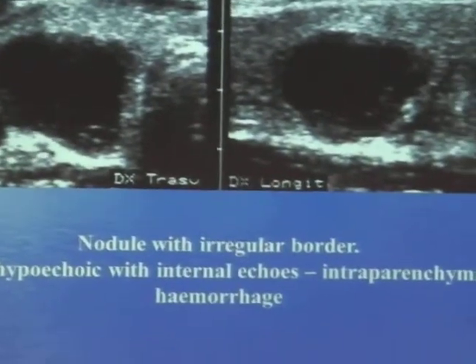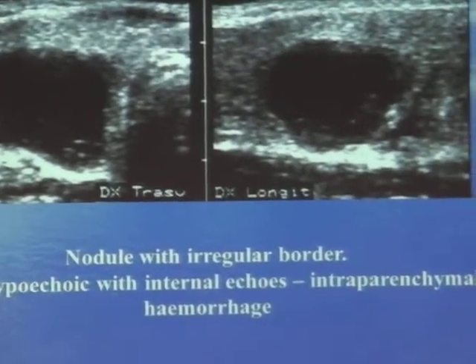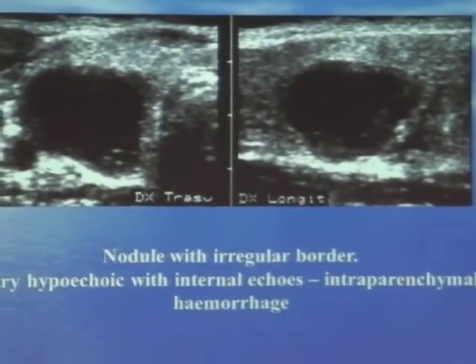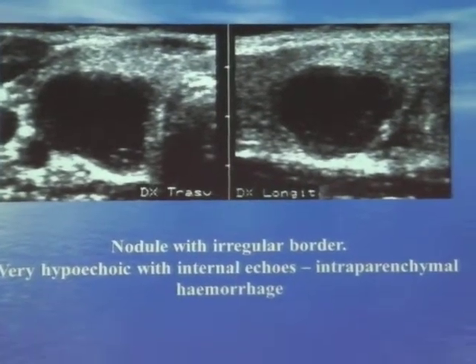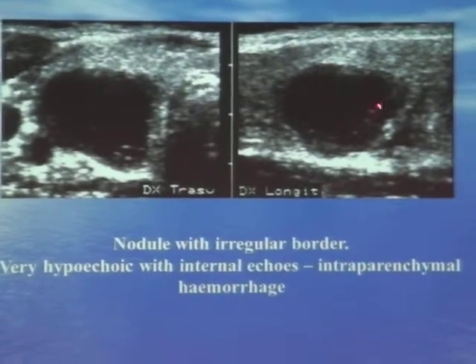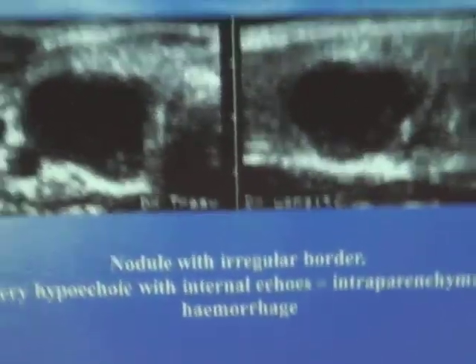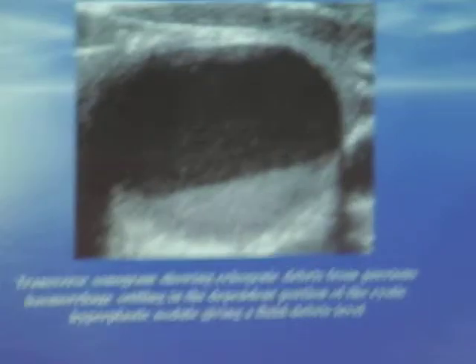Now if you look at cysts anywhere in the body, whether it's in the thyroid, the breast, or the ovary, you classify your cysts as simple cyst and complex cyst. A simple cyst is a cyst that you can draw the outline of with a pencil. It is very thin, very nice, nothing inside, completely black or anechoic, which means it looks completely black without any echoes inside. The moment the wall of the cyst becomes slightly thicker, or you see internal echoes, like dots inside, this cyst no longer is simple and it becomes a complex cyst. It doesn't mean that it's malignant, but it just means that it's no longer a simple cyst. It's a complex cyst and it will need further investigation or follow-up.